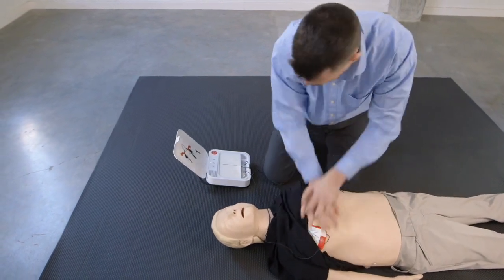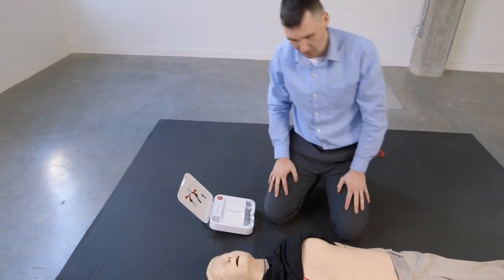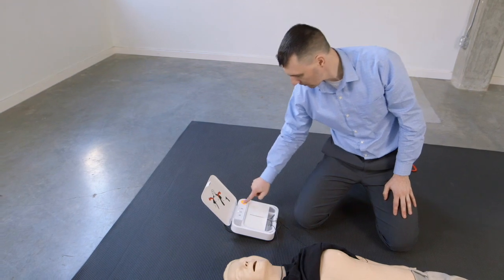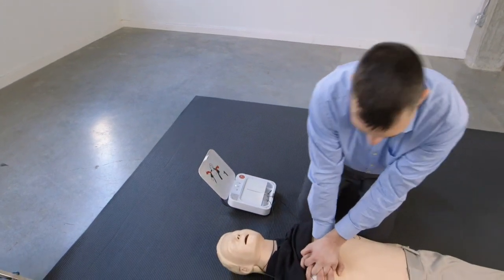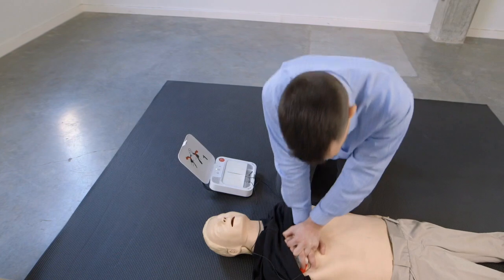Stoppa bröstkompressionerna. Rör inte personen. Tryck på blinkande knapp nu. Defibrillering levererad. Återuppta bröstkompressionerna. Tryck ner hårt minst fem centimeter.